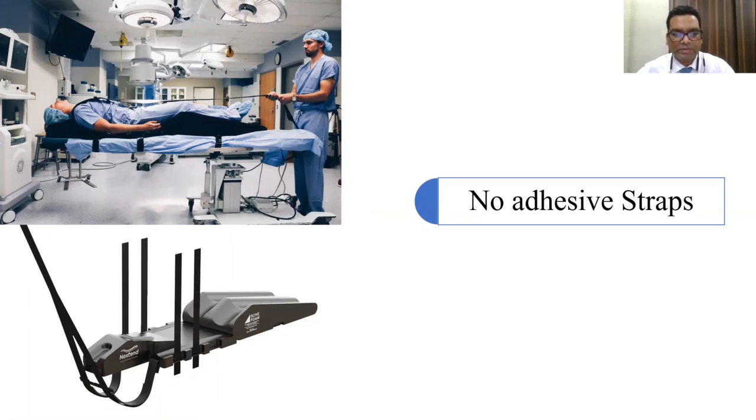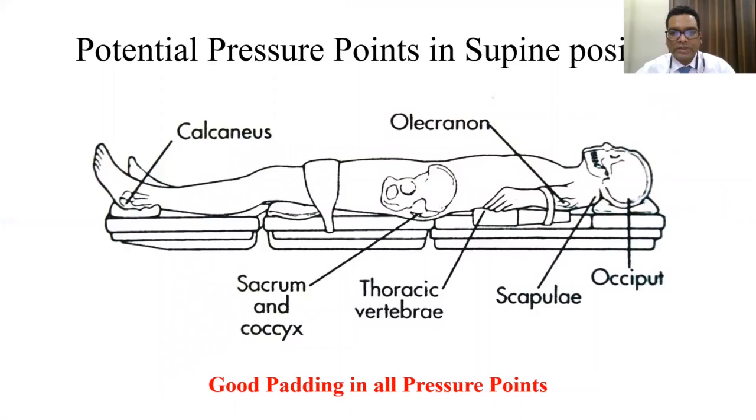This is one more modification, and these foam positioners are now available in the market. It has a custom-made interscapular pillow. It also has support for the knee. It also helps in the traction of the patient during the surgery.